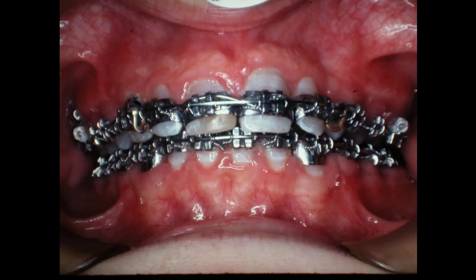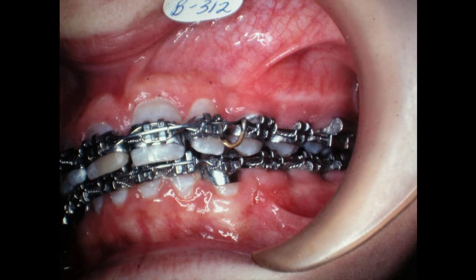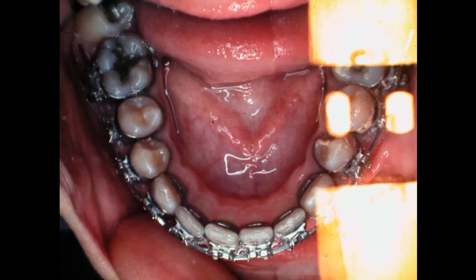But what I wanted to show you was, on this Panorex, you just can't see much in there. You can kind of see the gap in the area. And I'll show some more here in a few minutes to show you where it was. So we went ahead and finished it up, and we'll try to close that space. We are closing on both sides over there. We got a gap over here too, and here. When we get through, it looks pretty good. Be off just a little bit. Your midline, you can't hardly help do that. This is a pretty bad picture, but this was back in the days when you had to take pictures and send them off.